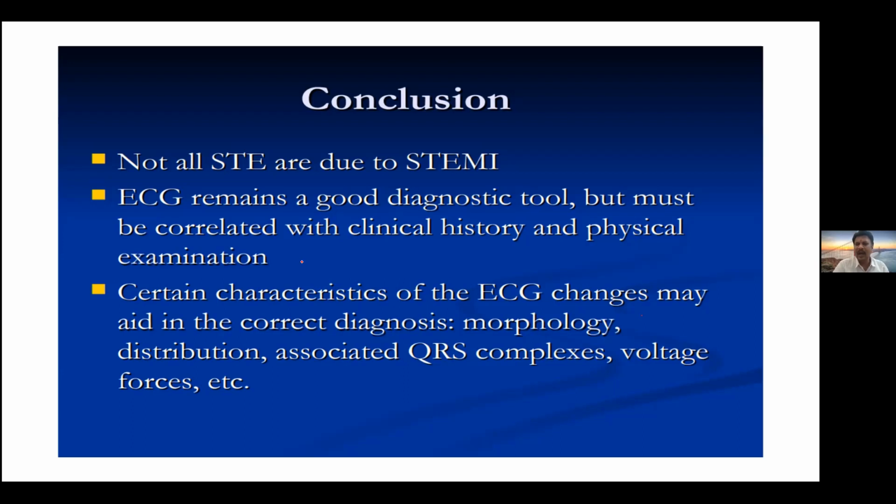After this, whenever you are putting up an ECG for discussion, everybody should commit, whether it is convexity upwards or concavity upwards, consider the background history, and from there go on to the diagnosis. So my whole aim of the class is to ensure that everybody is diagnosing the ECG properly. Thank you for the patient hearing. I'll stop sharing. If there is anything in the chat, I'll be happy to answer.